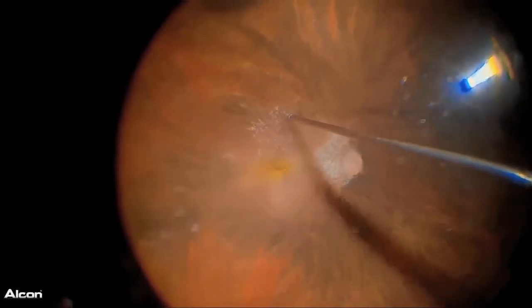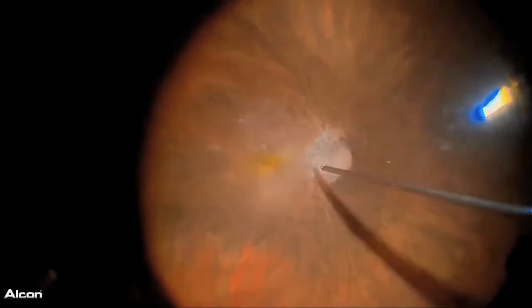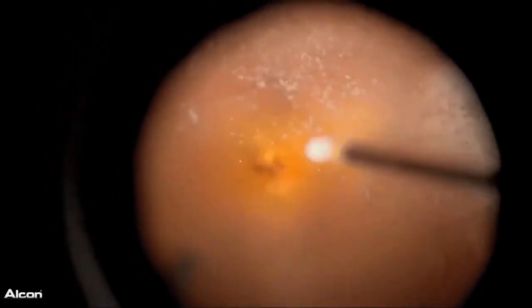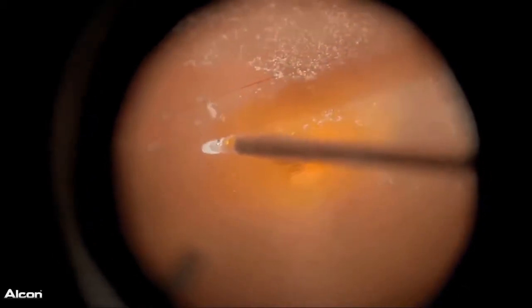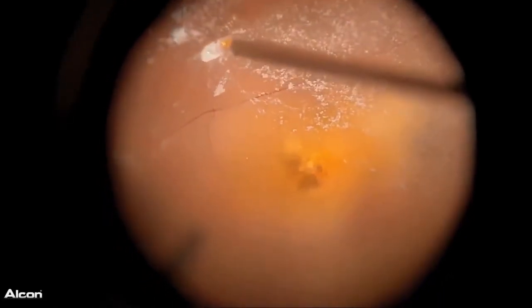This is another case of retinal detachment due to a macular hole in highly myopic eyes, with the Ingenuity system. This is the diamond dust scraper. It's very useful to remove the posterior hyaloid membrane stained with triamcinolone. As you can see, the triamcinolone stained membrane is easily removed with this scraper.